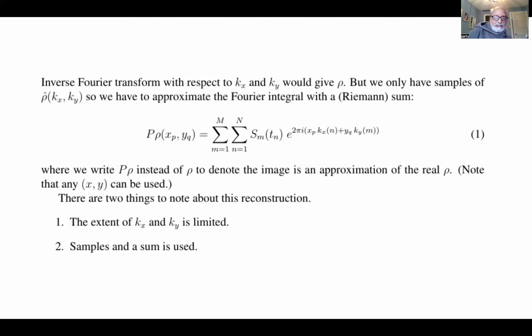There are nice, cool mathematical reasons why that works, but the bottom line is it gives you this particular sum, and you have to worry about shuffling frequencies and things like that. A lot of packages that you would get will handle all of those details for you without you having to worry about them. Okay, so this is how we get from the signals.